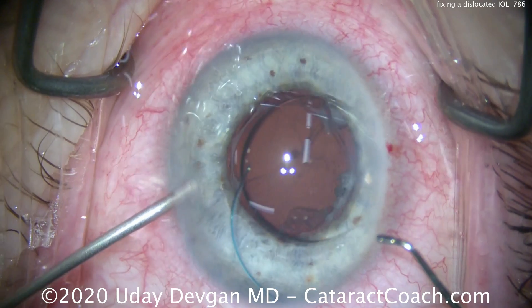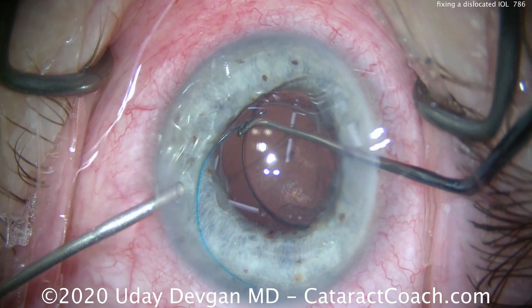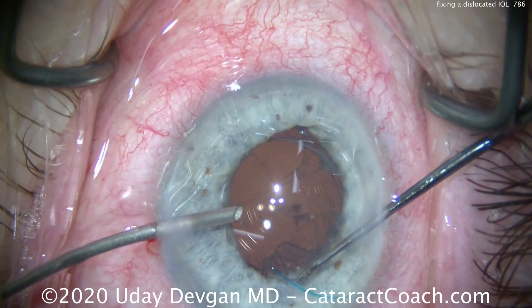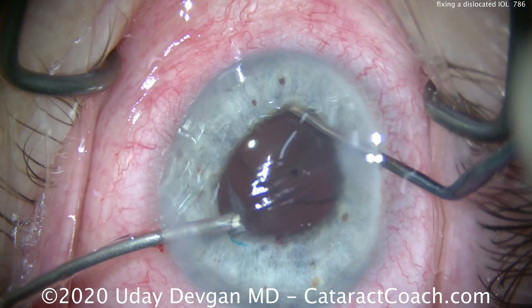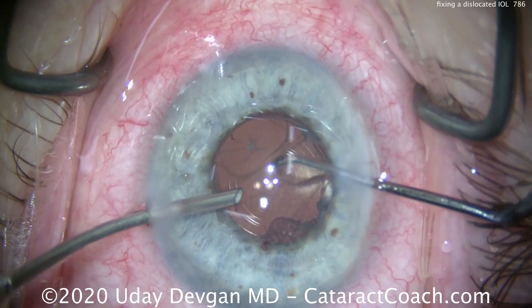Once we've cleaned up all the prolapsed vitreous, we get the IOL back into position. Using the infusion in the left hand, we dial in the haptics. Fortunately, we have a very good anterior capsular rim here — anterior capsular rim for 360 degrees, complete support. There's the other haptic going in the bag, and we'll get that optic nicely centered.